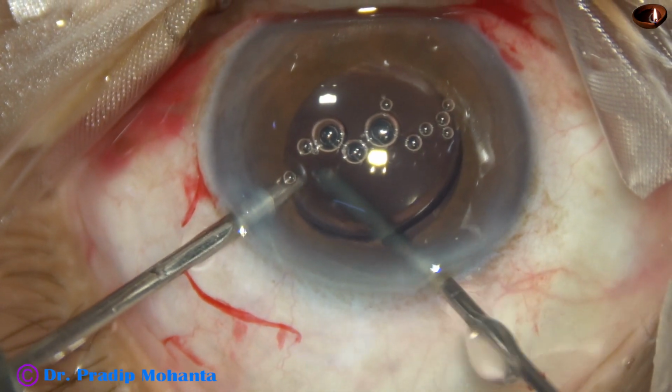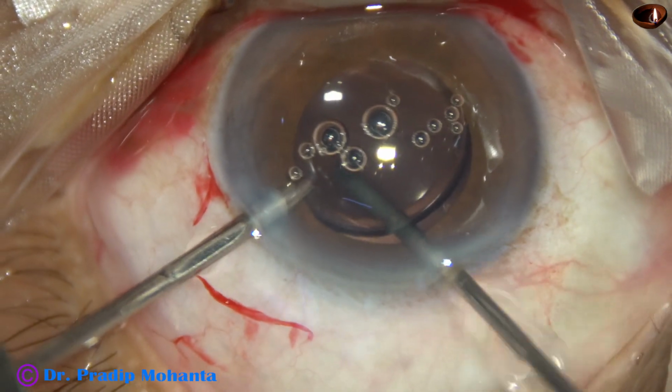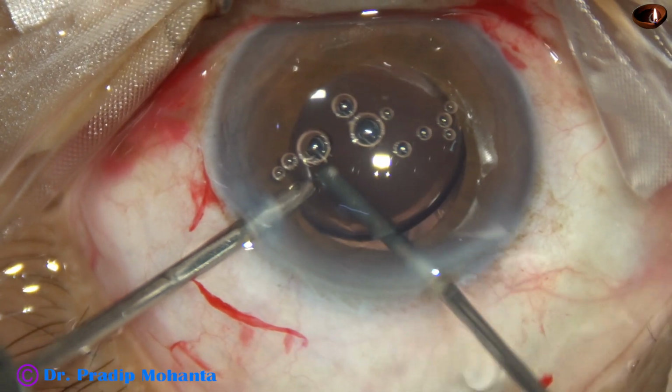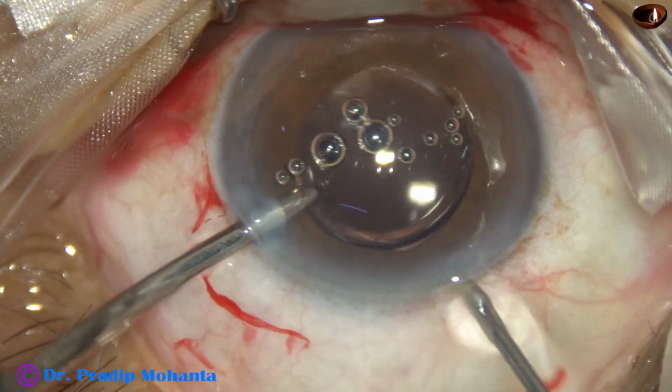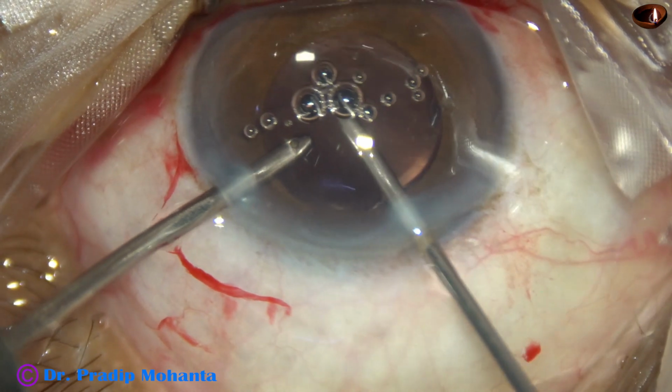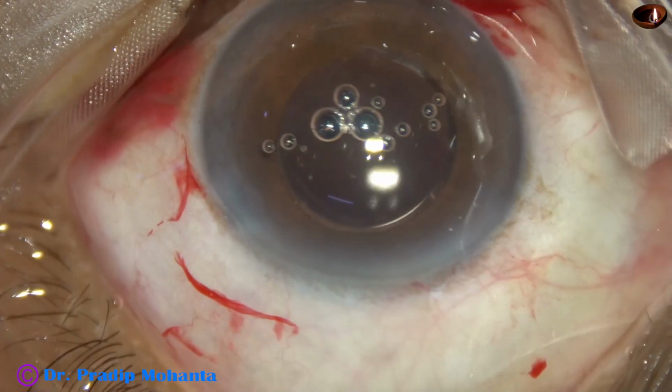We must use triamcinolone acetate judiciously, should not use a lot of triamcinolone acetate. It can cause raised intraocular pressure in many cases, so you have to be cautious.